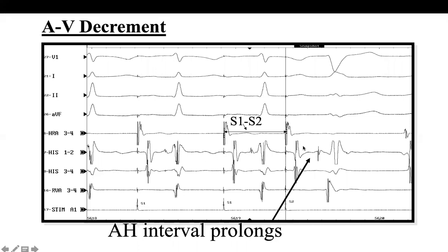So AH, then ventricle. This AH has to prolong if you shorten the last beat, from S1 to S2. S1, the stimulus 1, may be 8 beats, or 1 beat, or 2 beats, or 10 beats, it doesn't matter, but in most labs we use 8 beats. The 8 beats are S1. The S2 is the one that we bring earlier than usual.